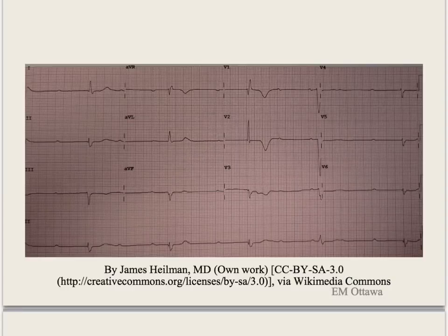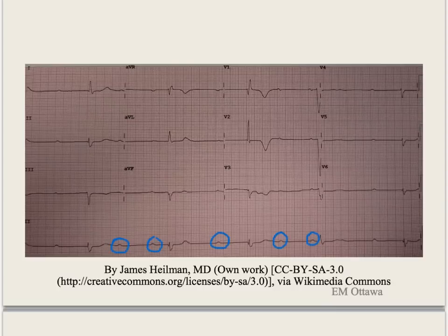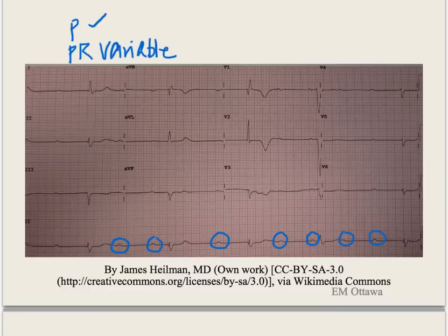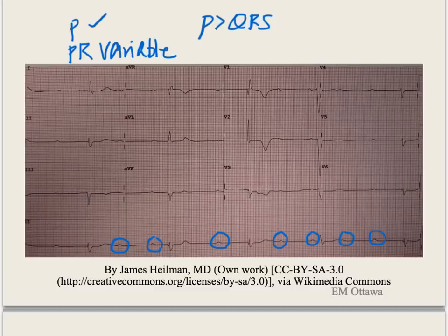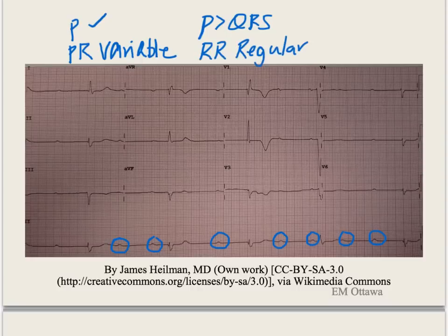Let's apply our criteria to a 12-lead ECG. P waves can be picked up fairly easily in lead 2. The PR interval is all over the map. There are way more P waves than QRS complexes. The RR interval is regular, and the QRS complexes are narrow. Based on these criteria, this is another example of complete heart block.